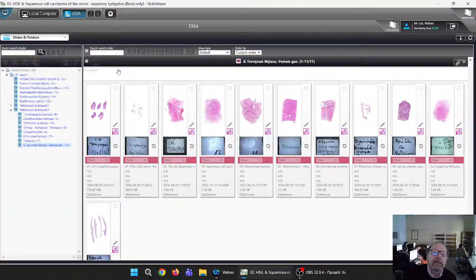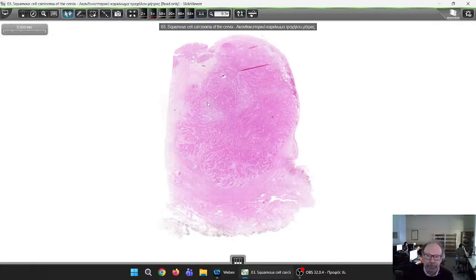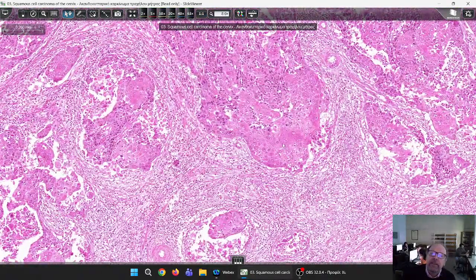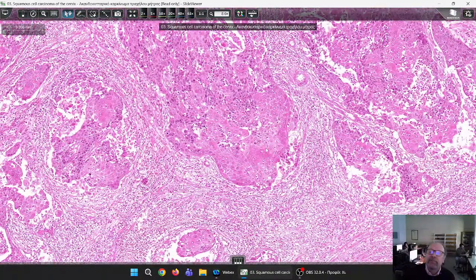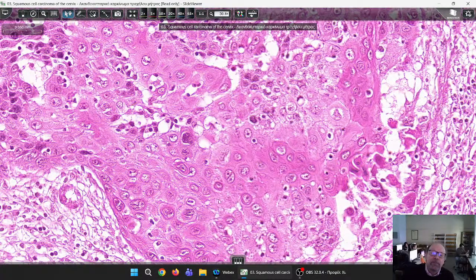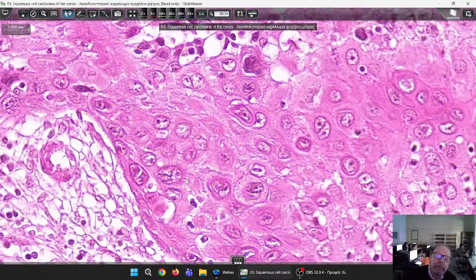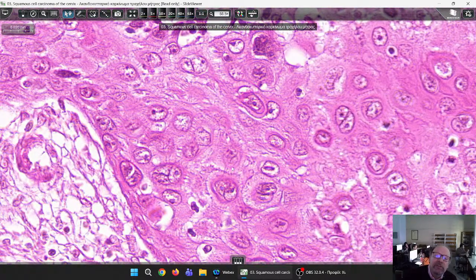And when we look at the other invasive cervical carcinoma, here this is somehow better differentiated, because we can see that there is enough cytoplasm. And what else can you see? Look here, this is consistent with squamous cell differentiation. What can this be that I show you? And we always look for it in the slide, because this proves that these malignant cells are squamous cells.